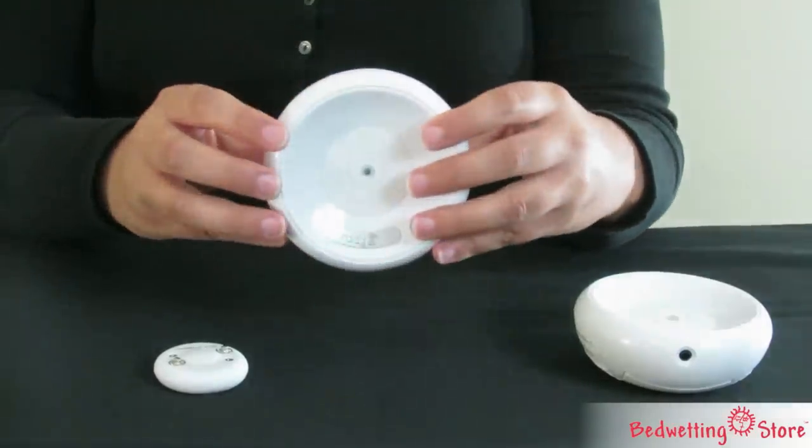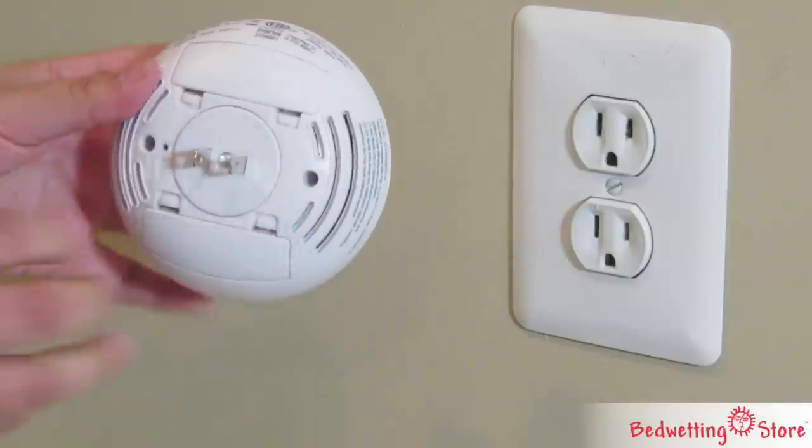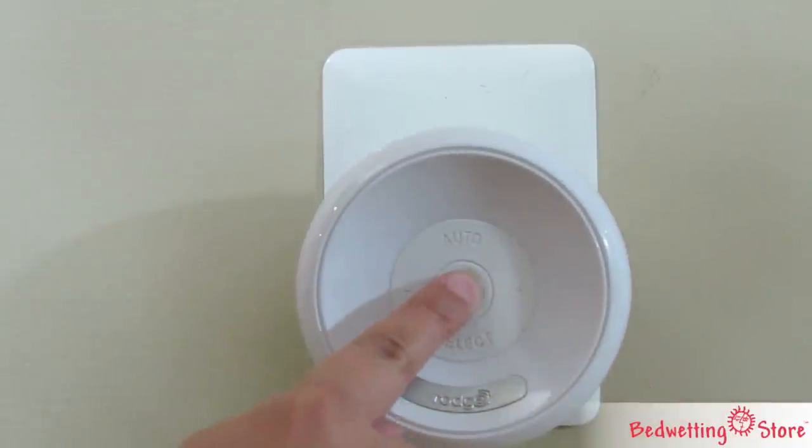The Roger Wireless is an easy to use bed wetting solution. To turn it on, simply plug in a receiver in your room and your child's room and press the central LED button. The alarm transmits up to 100 feet.